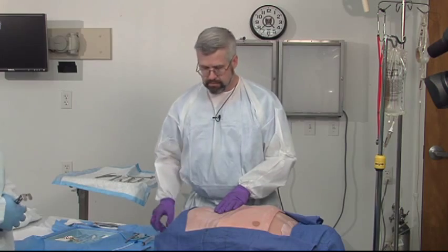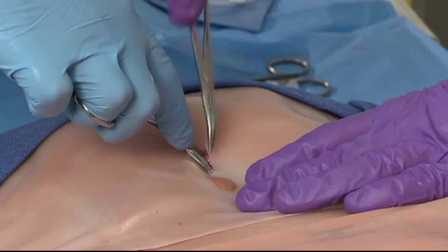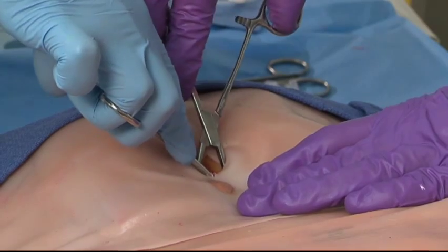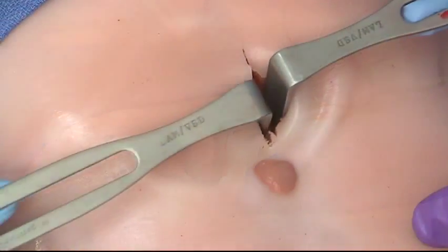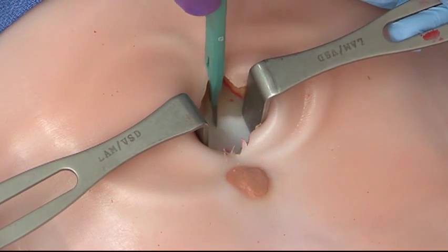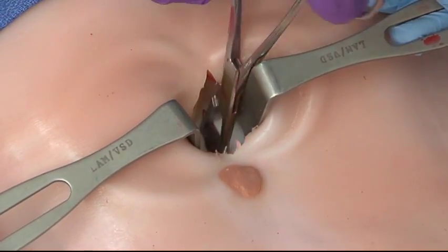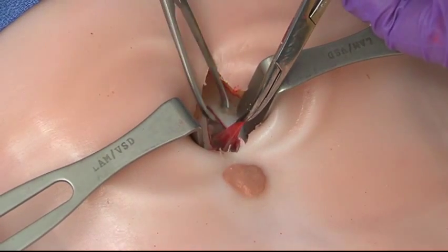At this juncture, it's useful to have an assistant. I'm going to spread with my clamps in one direction; my assistant will spread the opposite direction. We're trying to find the anterior fascia — it looks like we're getting down to it. Now we're going to put in some retractors; Army-Navy retractors are very good for this circumstance. Now that we have the anterior fascia exposed, we're going to incise it in the midline using the knife. Here you see it being incised, and what should come into view is a little bit of preperitoneal fat. We're now going to spread this preperitoneal fat, looking for the peritoneum.